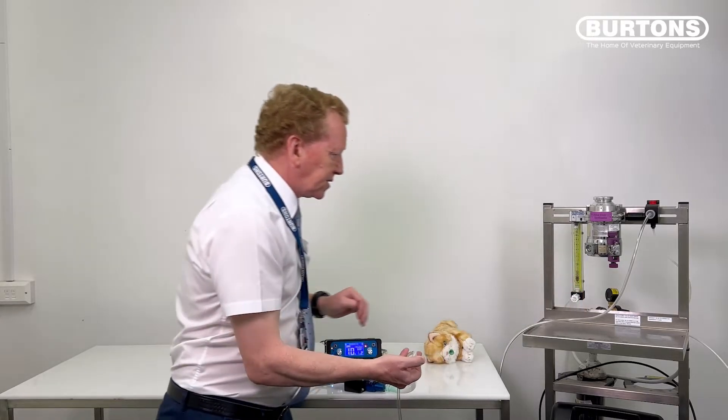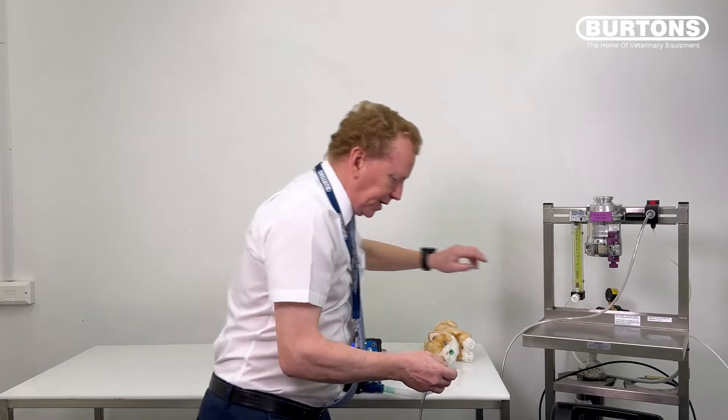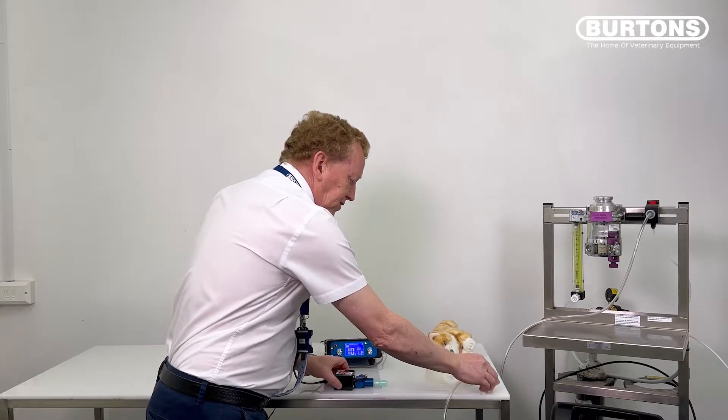That's the dynamic test done. Turn the oxygen off, and now we're ready to connect the patient and start ventilating.